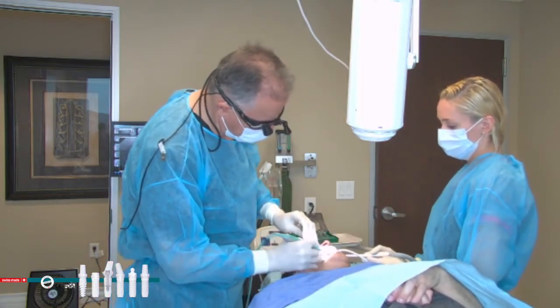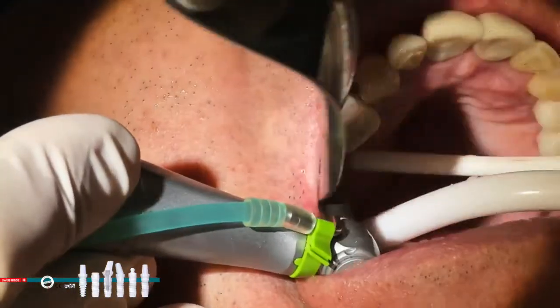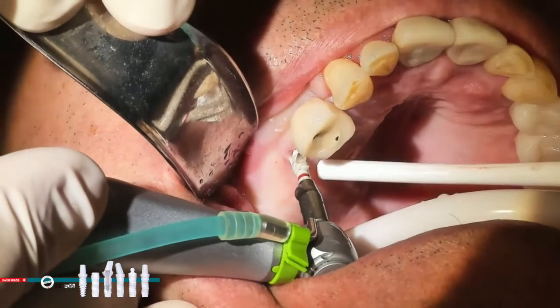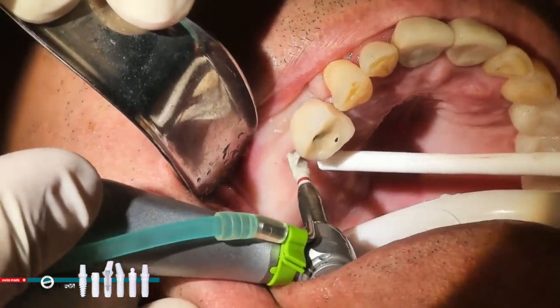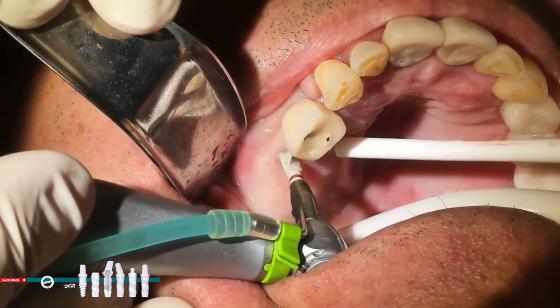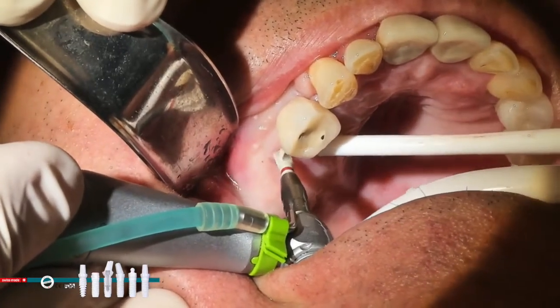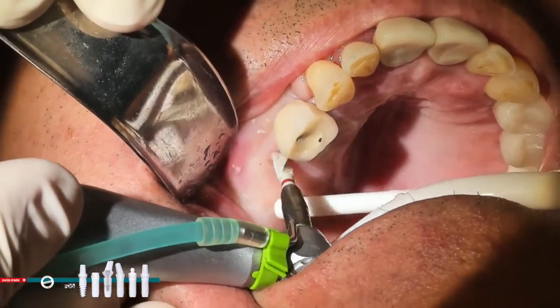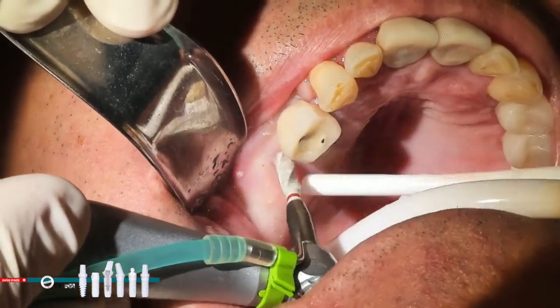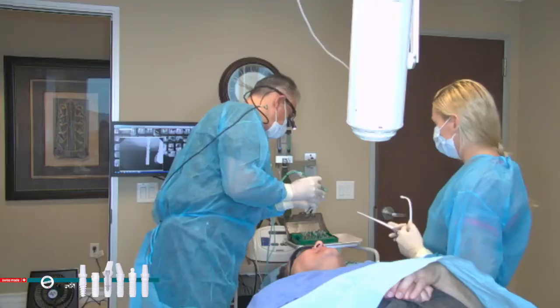Turn away, please. Open wide. A little wider. Thank you. You just make sure it's parallel every time you take the drill in the osteotomy, so you don't go at an off angle. So, and our last drill is just a countersink, which is the red one.